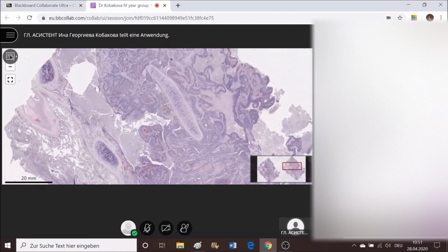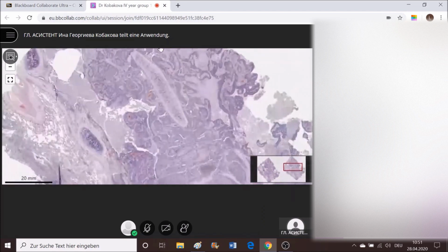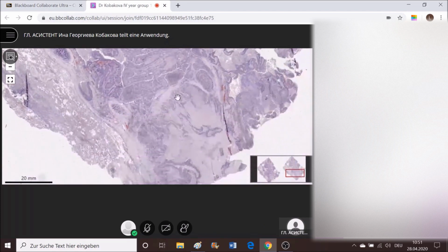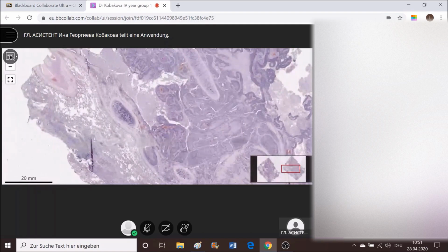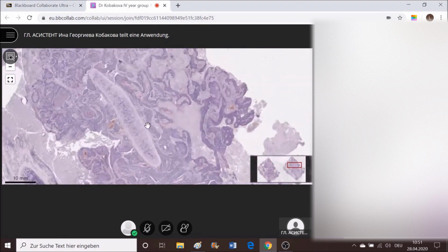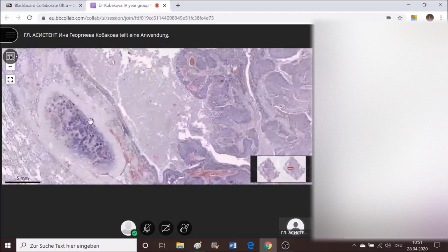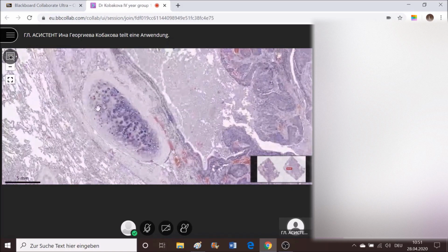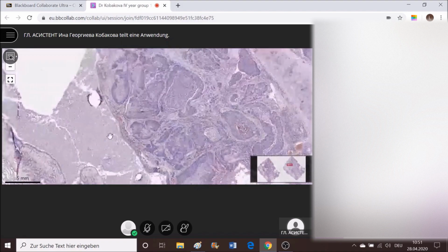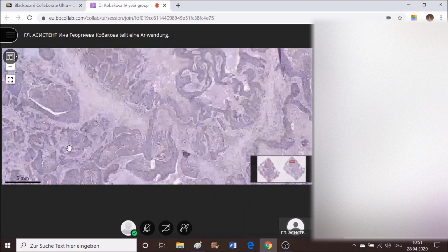So, found it. Great. So, take a look at this organ again. What do we recognize here? Not much. A bronchus. Okay. Why? Because of the cartilage here, right? It's centrally positioned. It's purplish. And next to this place, again, one cartilage here, a place which is filled with multiple nests of cells.